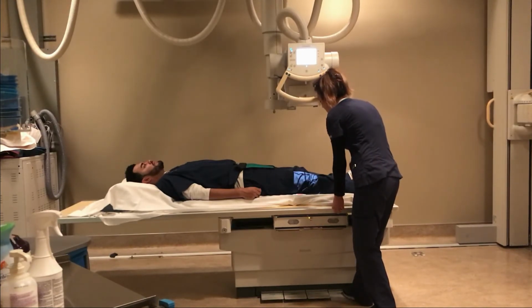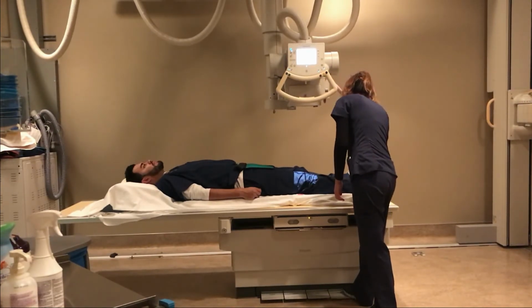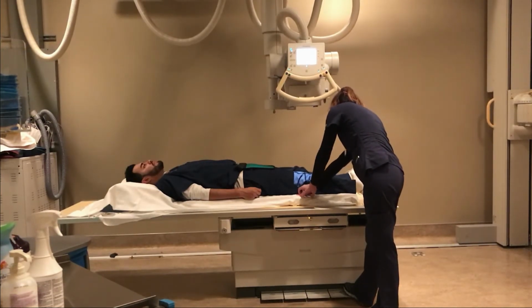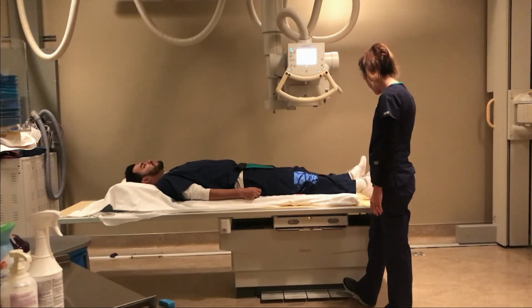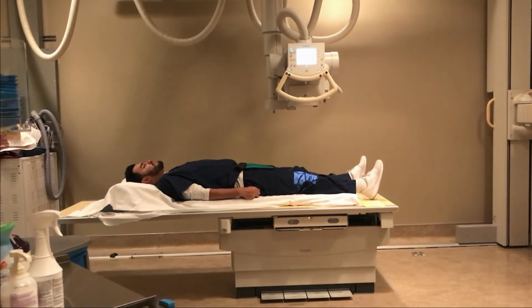I'm just going to move the table a little bit to be in line with his leg. Okay, and his leg is rotated 45 degrees. And we'll go take the x-ray. So Phil, go ahead and just stay still. X-ray.